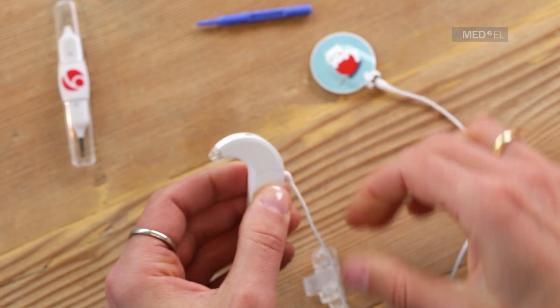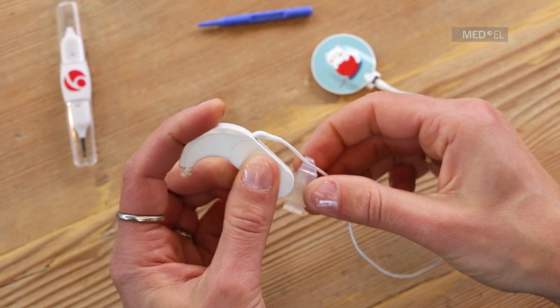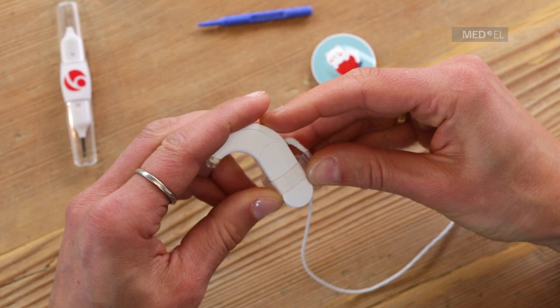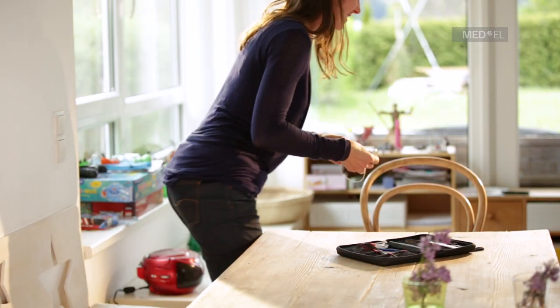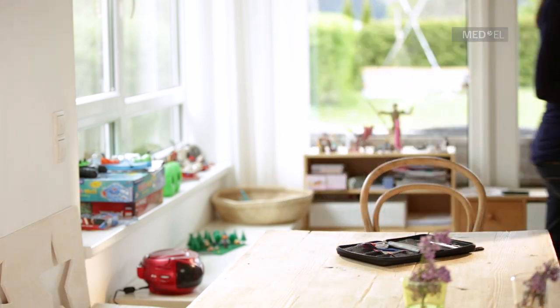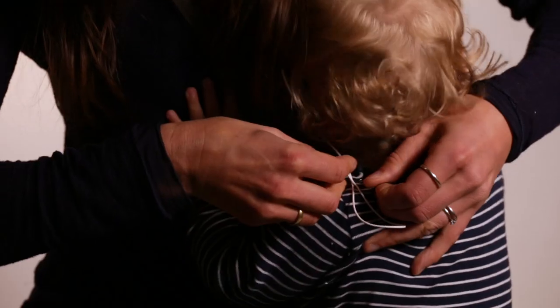Slide the silicone ring of the attachment clip over the audio processor. Switch Sonnet to omnidirectional microphone mode. Then attach it to your baby's clothing, making sure the microphone is not covered and is facing forwards.